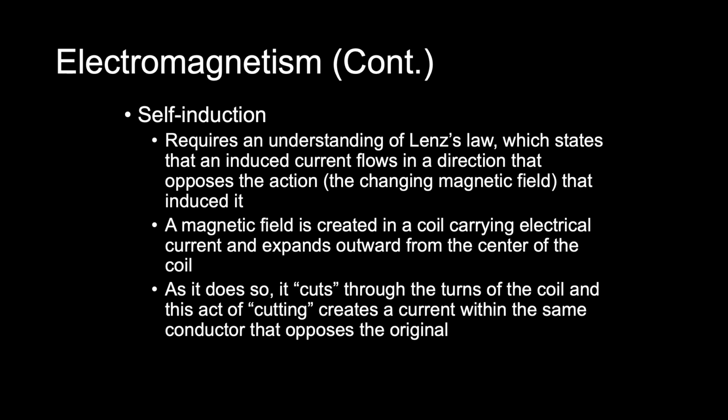Going back to the example of the primary coil that we saw on the other slide, the magnetic field is created in this coil and expands outward from the center of the coil. As it does so, it cuts through the turns of the coil, and this act of cutting creates a current within the same conductor that opposes the original one. This is Lenz's law.